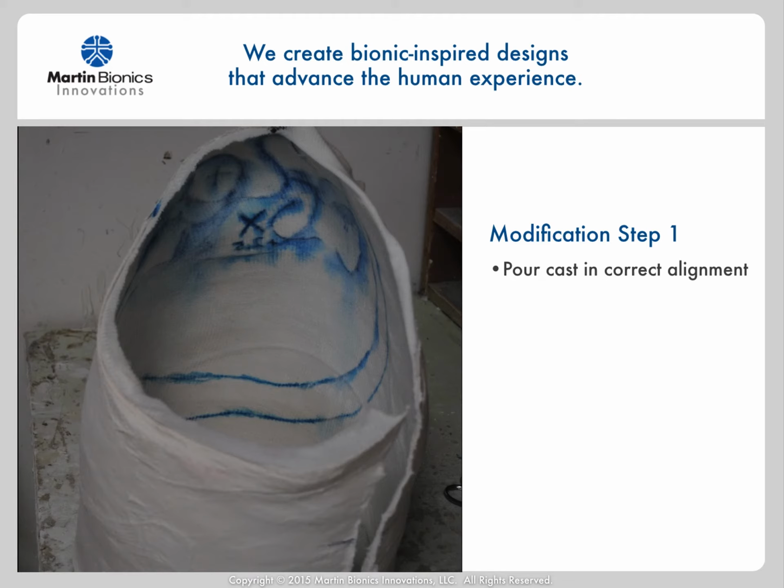This should be the simplest shoulder socket modification you will have ever done. If you took a great cast, almost all you will need to do is smooth the cast. Since you will have already marked the socket trim lines and alignment lines on the cast itself while still on the patient, you should know the proper orientation.